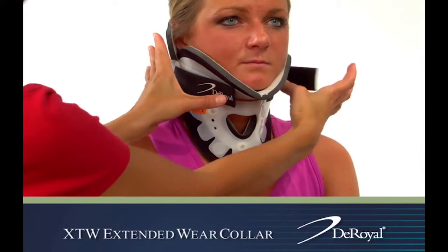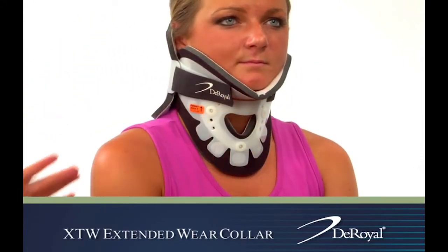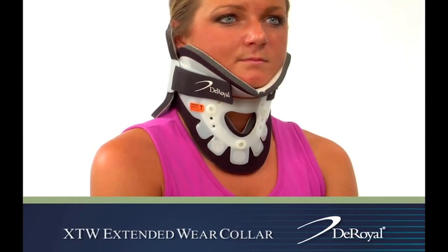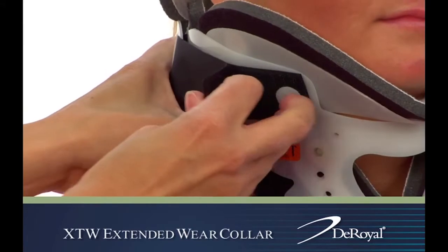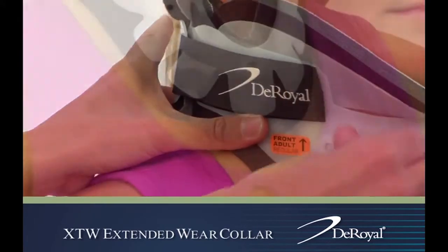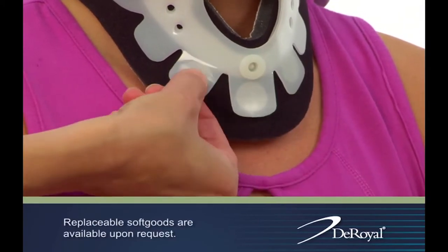With the front portion properly secured, use the bilateral hook and loop straps to fasten the portions together. To improve comfort, minor adjustments can be made to the straps in the front and back flex tabs.